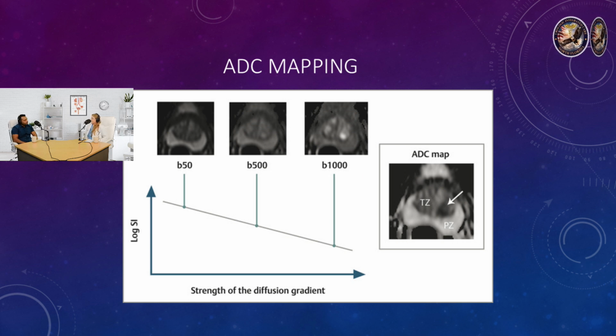The MRI is just full of information that I think in the future we're going to be able to find more and more features that help us be more accurate.